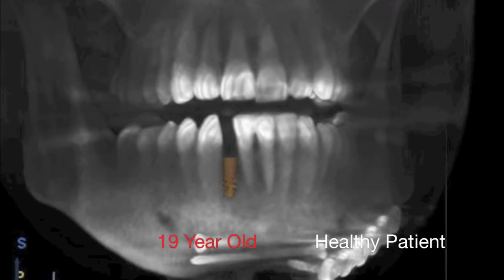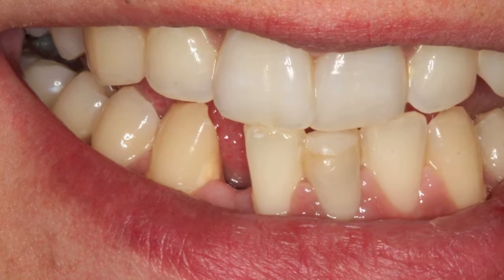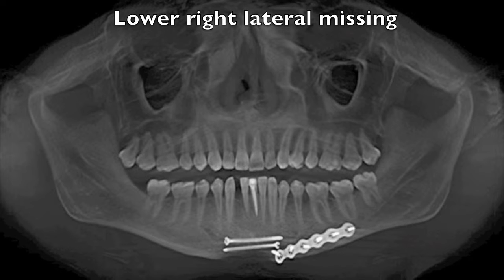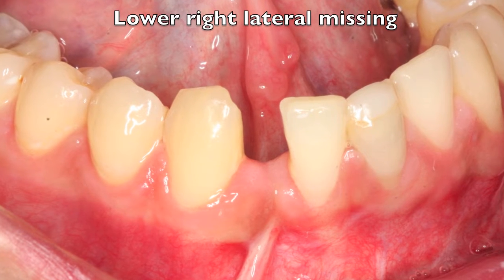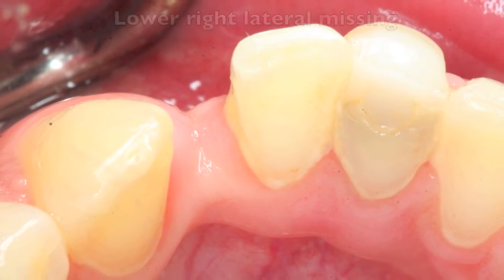The patient was a 19-year-old healthy patient. He recently had a motor vehicle accident, causing him to lose a tooth and also to have his jaw fractured. Upon evaluation, you can see that the space was actually too narrow for an implant, so we had to do some orthodontics to open up the space.